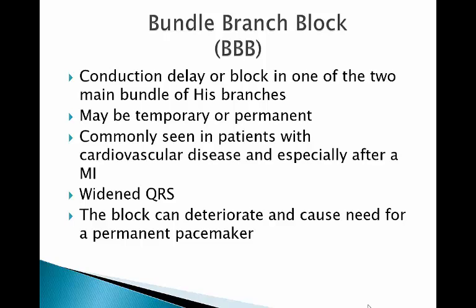Alrighty, this is the fourth installment of basic ECG interpretation. Now, in this podcast, we're going to finish things up. We're going to talk just a smidge about bundle branch block, and we've mentioned those in the previous podcast. We're going to talk about ventricular arrhythmias and then some common things that go along with dysrhythmias, including just a little bit about cardioversion versus defibrillation, which I know we talked about before, just a smidge, but we're going to talk about it again.